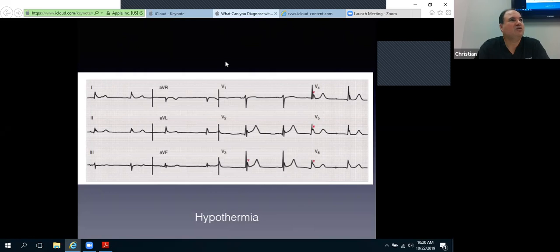And so by looking at the EKG, if I get this as a pre-hospital EKG, and they're like, this is what we're showing you, right? How often do they check temperatures before giving us a patient? And if they did, it wouldn't register, right? It'd be too low on whatever their automatic reading is. And so we would just get, hey, temperature's too low. Well, send us the EKG and see this. And we're like, okay, this is a severe hypothermia.